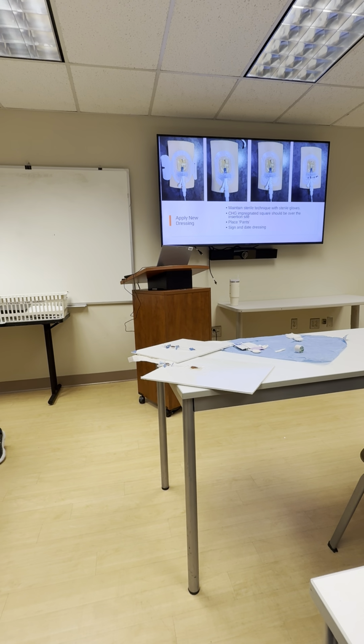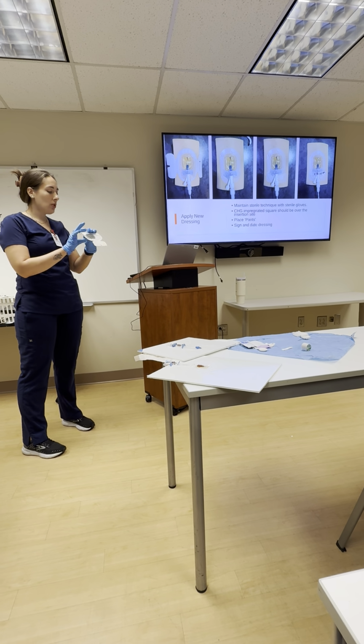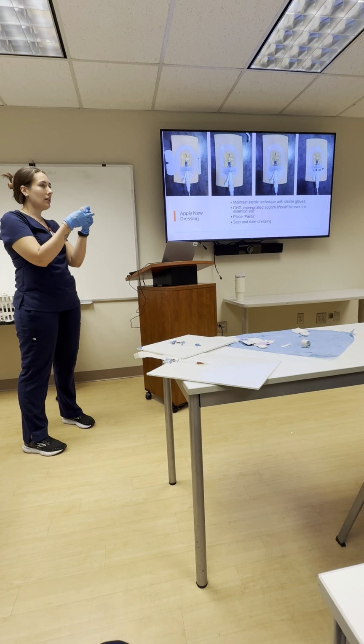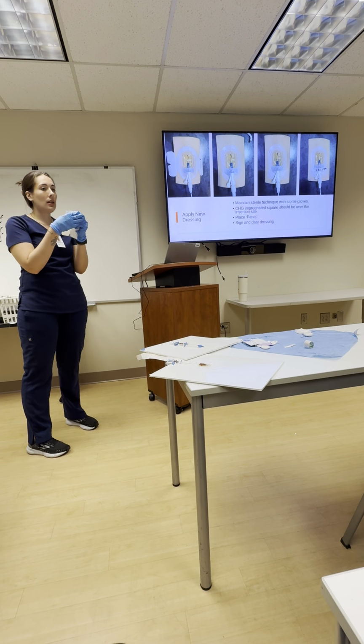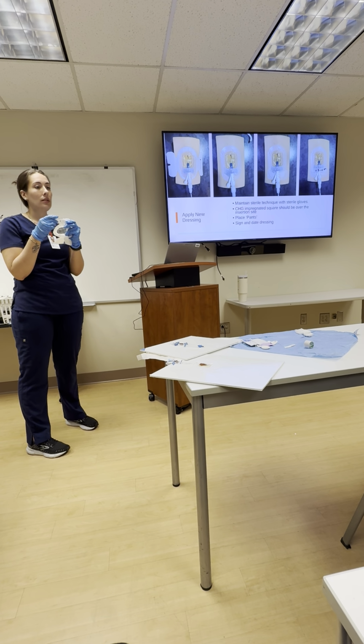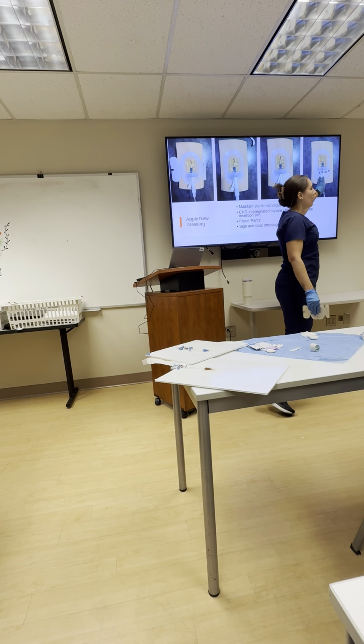Okay. Once everyone got that, does everyone have the pants on? So there's another piece that is important. It's like little dashes. This is our date sticker, so we're just going to date it, and we're also going to initial it. And then I like to put mine right on top of the catheter, like that.